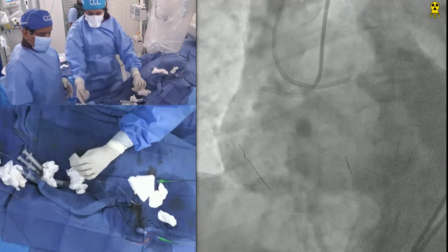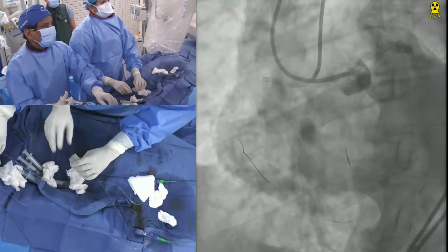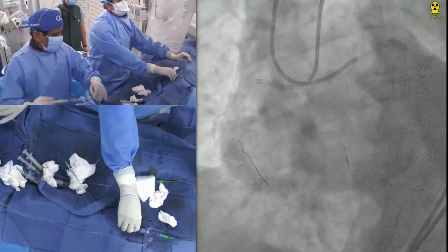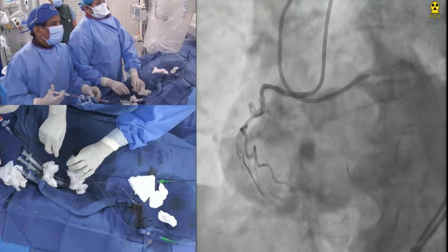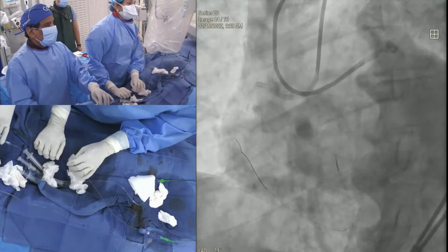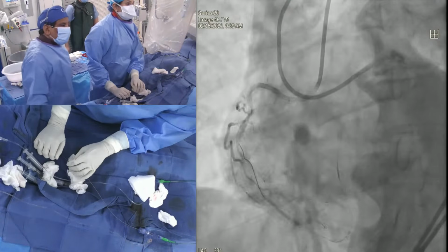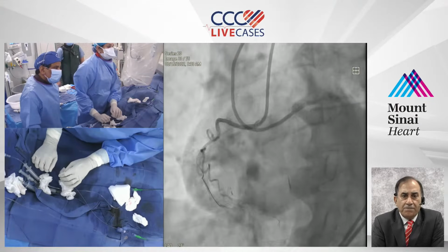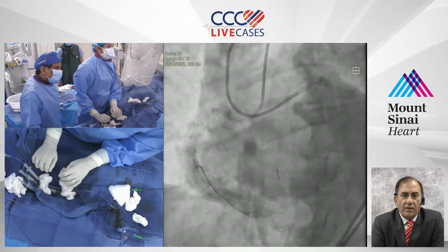Antegrade picture. Okay. Guide is out. Wrong picture. Antegrade, I said. Okay, ready? Yeah. Good. Go. So all the dye, this thing has stabilized completely. Which is how you had felt. Not to worry about the cloud.